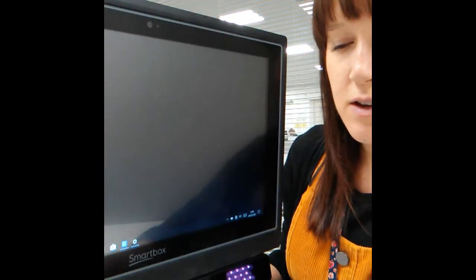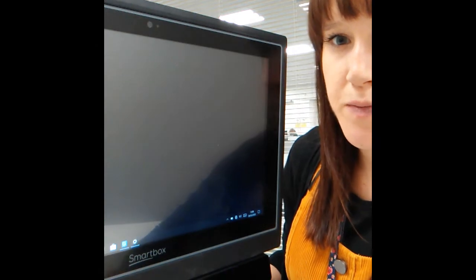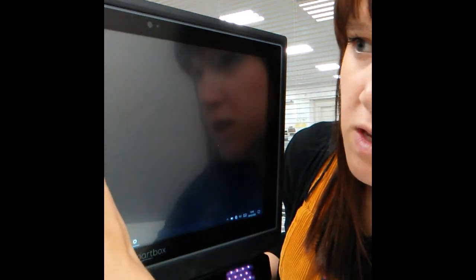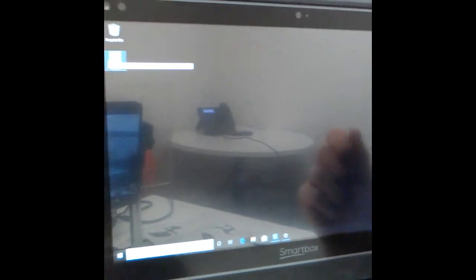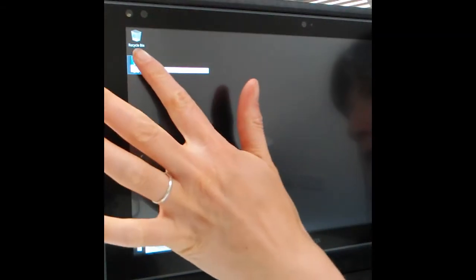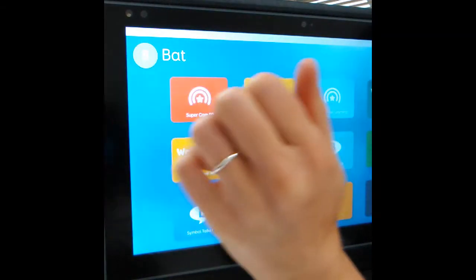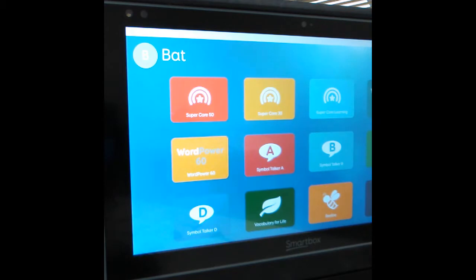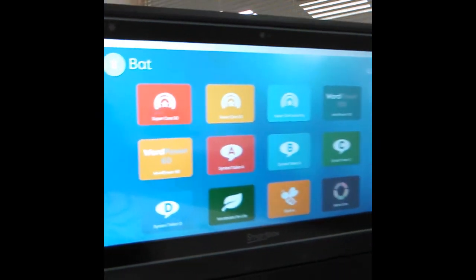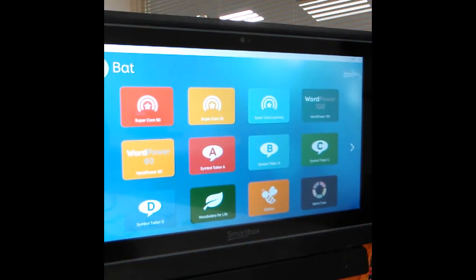You've got your screen here and you've got the camera at the bottom. If we go on to Grid, by selecting this blue square that should open up your Grid software. It might take a moment or two.